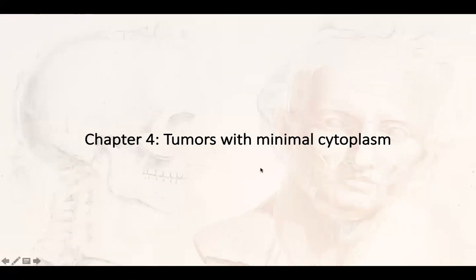Right on. Okay, so here we go. We just left off talking about PAs and Warthin tumors. Now we're going to get into some of the other interesting entities. These are a little more exotic tumors. Things are probably going to get a little more weird and confusing, but also a little more sexy.